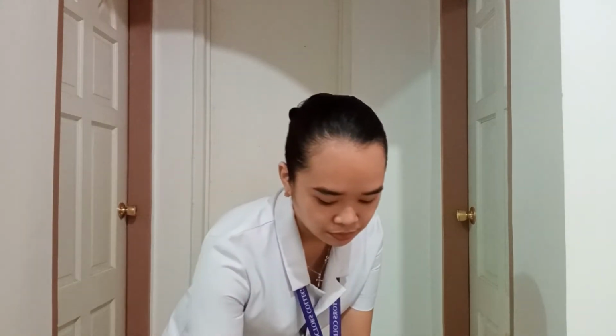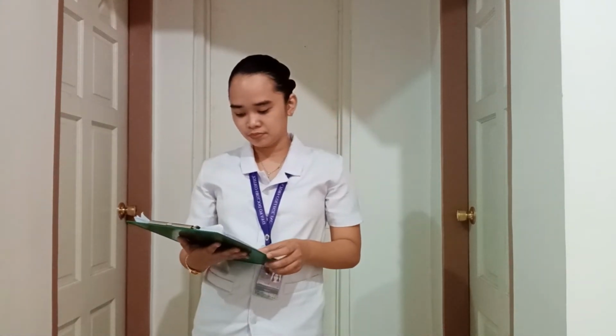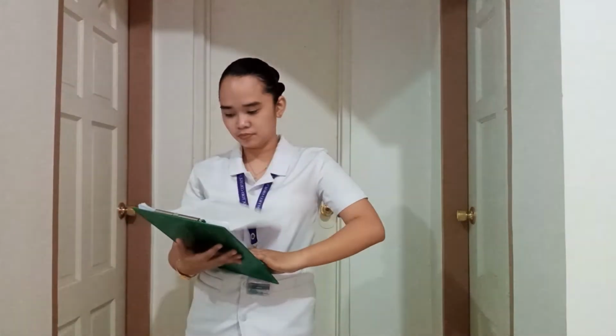Now I'm going to take the oxygen saturation of my patient using this pulse oximeter. So the goal of this procedure is that the patient should exhibit arterial blood gas saturation within acceptable limits or greater than 95%. So the first thing we need to do is to review the chart of our patient to check for any problems that might affect the patient's oxygenation status. Okay, so prior to the conduct of the assessment, I'm going to ensure the privacy of my patient by closing any doors and windows, and of course, I'm going to perform hand hygiene.